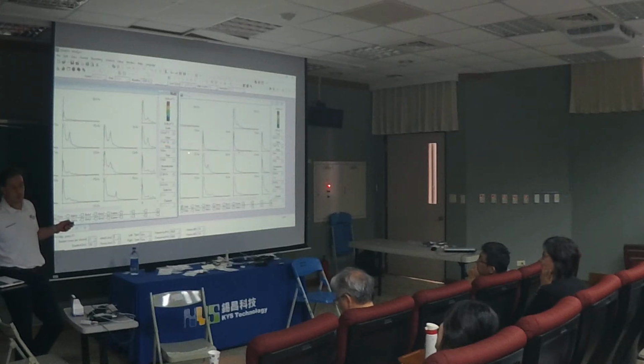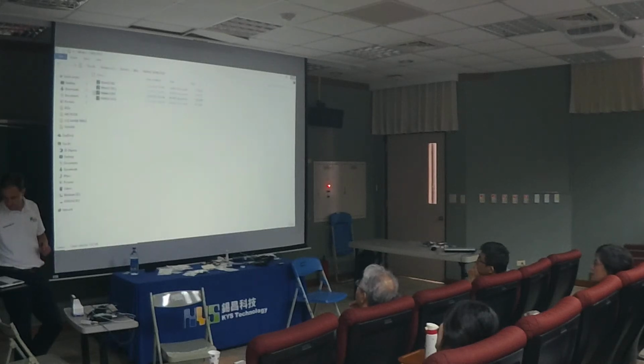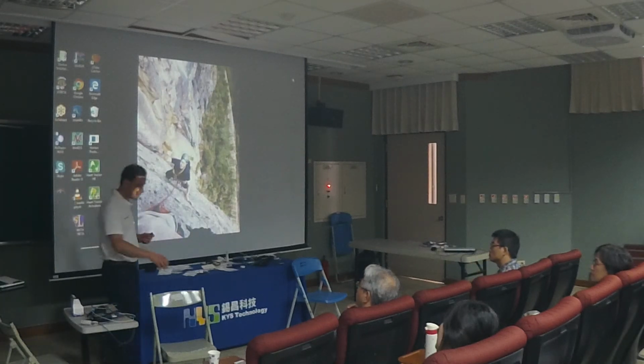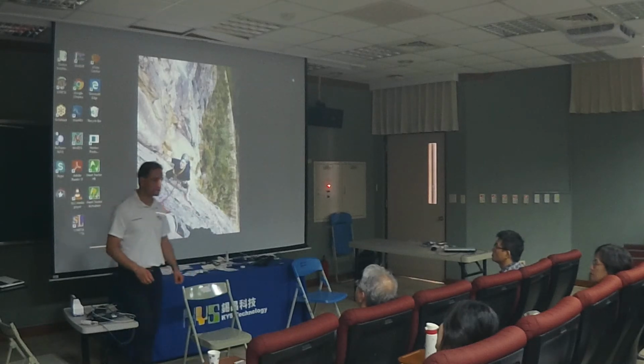So choosing the right protocol is key to that. All right? So how do we do that? I need a volunteer. I would like to get a volunteer for some training over here. And we'll take some time to look at some more EEGs. But I want to specifically talk about the training here. So who wants to come down and do some training? Anybody?